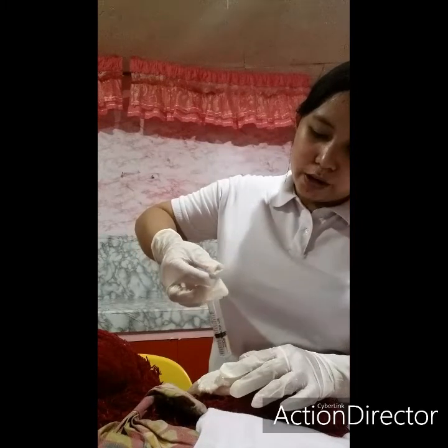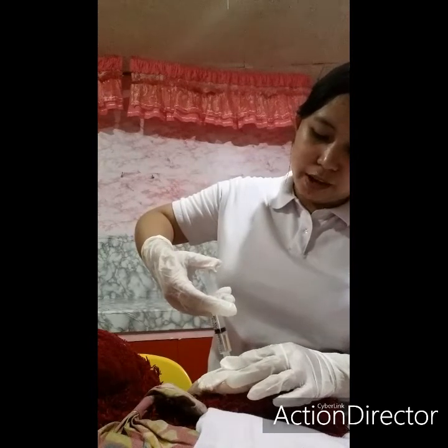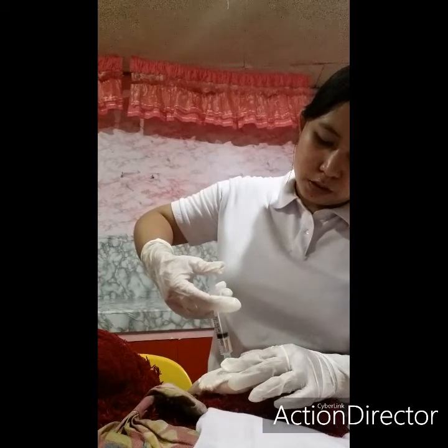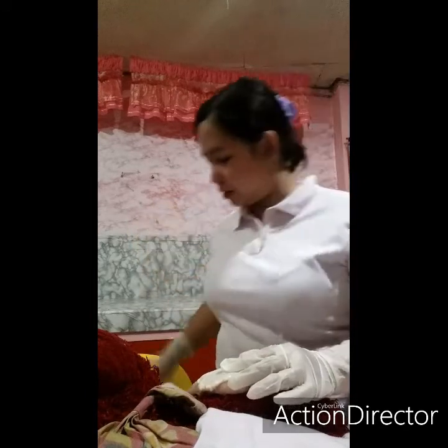In intramuscular injection, we need to aspirate. If there's blood in it, it means we have punctured a vein or artery. If not, then proceed. Release and put a dry cotton. Massage the area for the medication to spread in the muscle area.